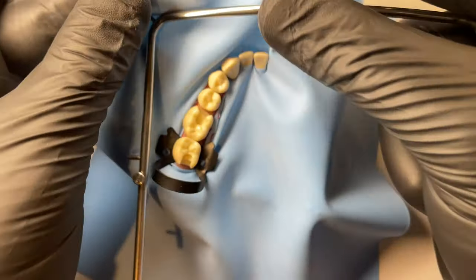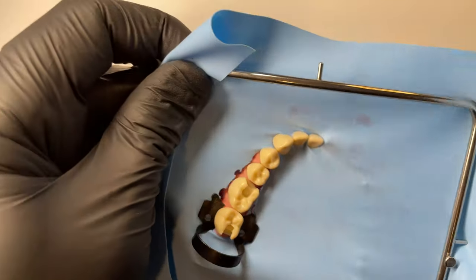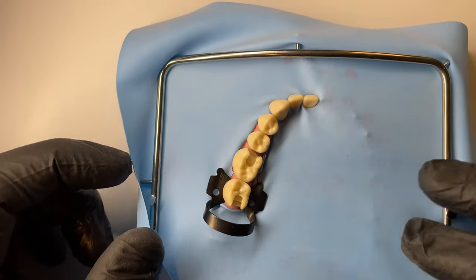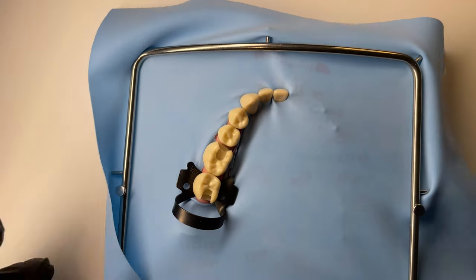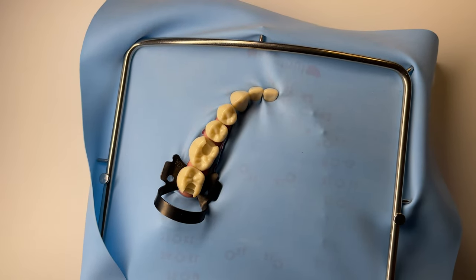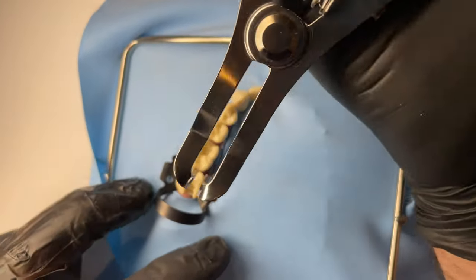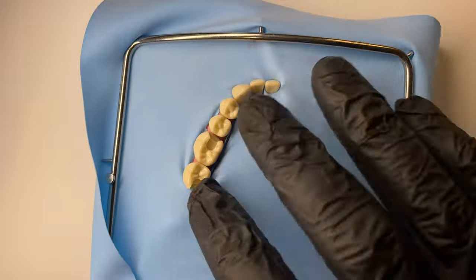The reason I like to do this with the winged 12A/13A is that the wings help retract the dam a little bit. Once you've got the big split in it, if you use a wingless it can fold over. With the winged clamp it's very helpful at pushing out lingually and buccally to give you the retraction. That's what we're using this dam for — it's a retraction aid. I find it much better than an Optragate. Then I'll change up for a formal dam for any bonding procedure.